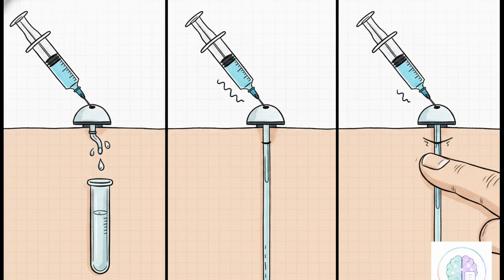Now here's the absolute most critical mechanical step. You must occlude the distal flow by compressing the valve or the ports while you inject. This is what ensures the isotope actually goes where you need it to. Finally, you just flush the isotope in using the remaining CSF you drew earlier.